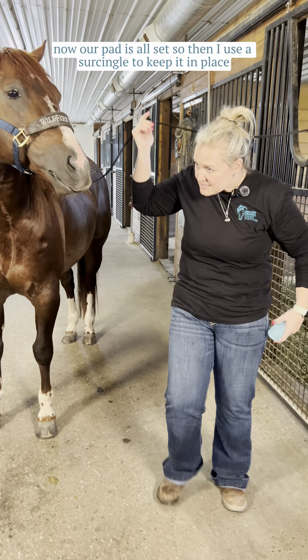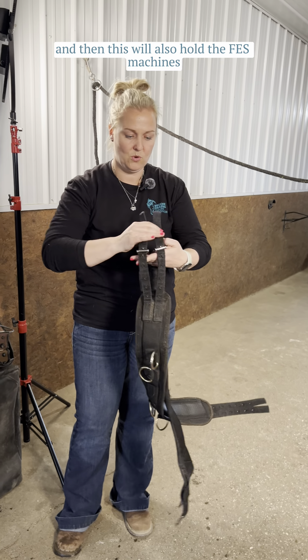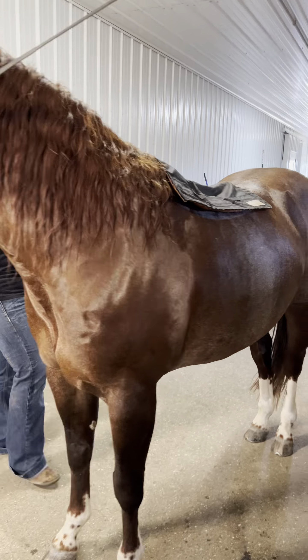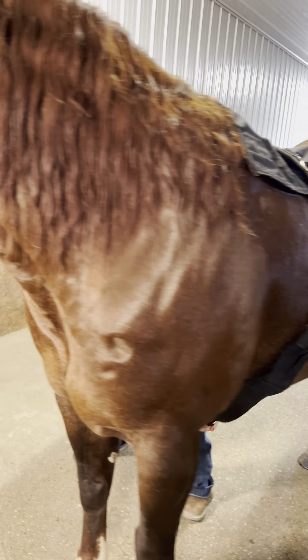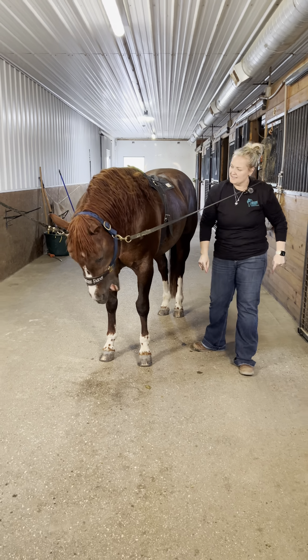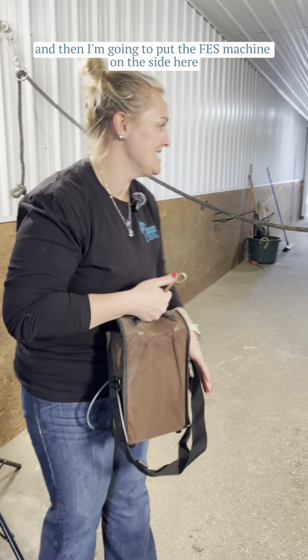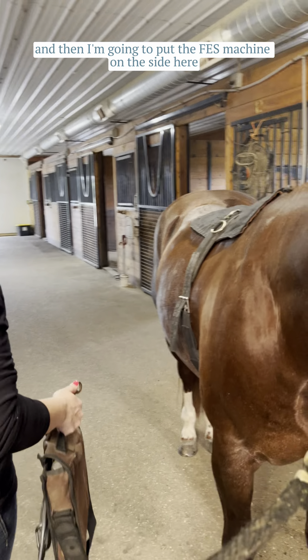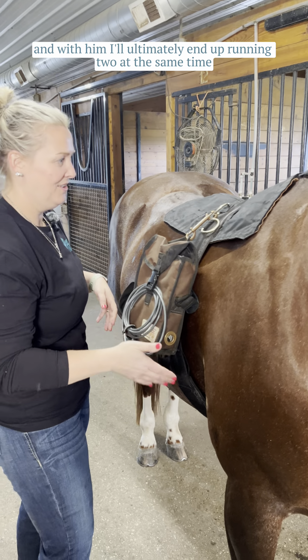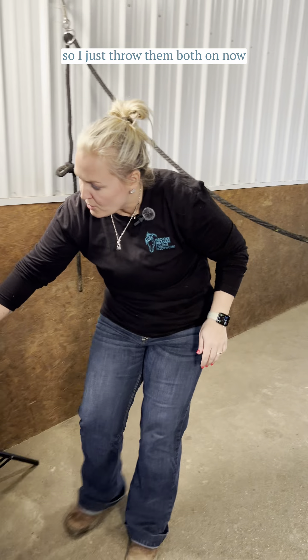Now our pad is all set. I use a surcingle to keep it in place, and this will also hold the FES machine. Then I'm going to put the FES machine on the side here. With him, I'll ultimately end up running two at the same time — one for his neck and then one for his hind end — so I just throw them both on now.